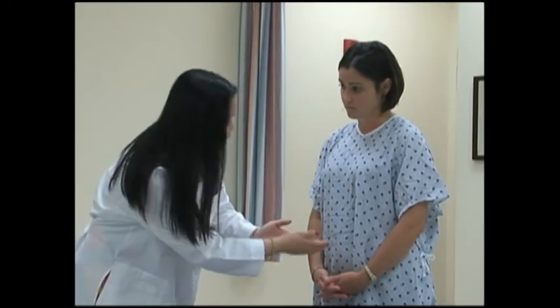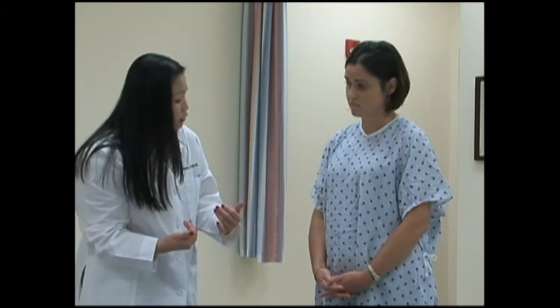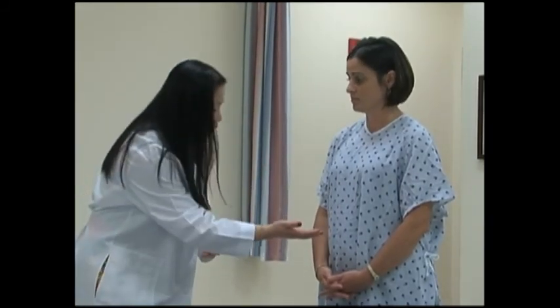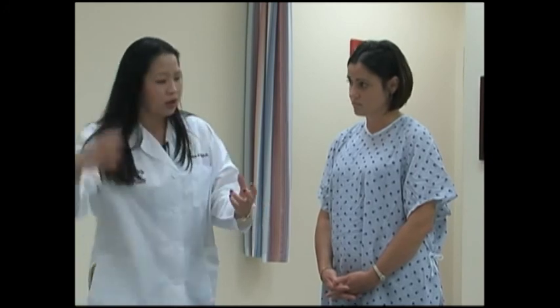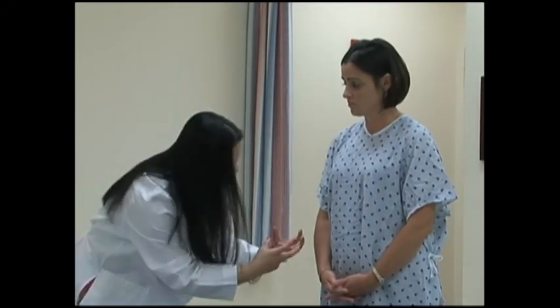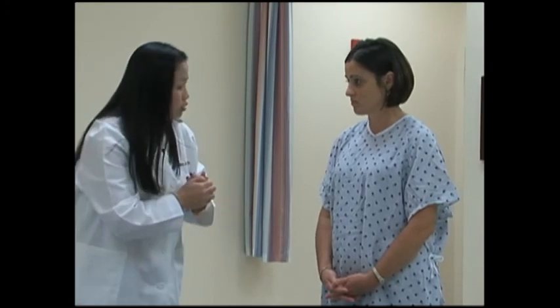And what we're going to do is we're going to visualize the lymph nodes of the pelvis. We're going to visualize the tumor bed, or where the cancer used to live. But at the same time, we're going to need to visualize the bladder and the rectum and the small bowel and the ovaries, which you still have in place, and basically create a customized treatment field with beams coming from multiple angles of the body to try to pinpoint focus the beams right there on our target area, while making sure that our normal structures are well protected.